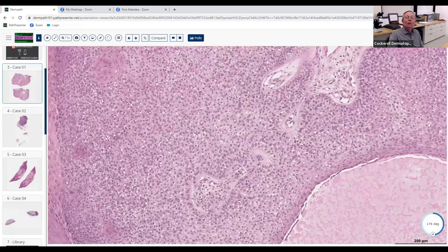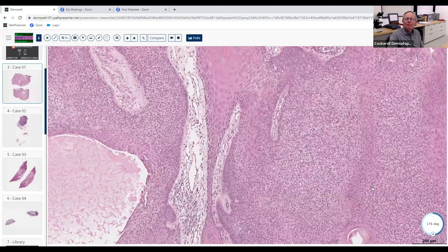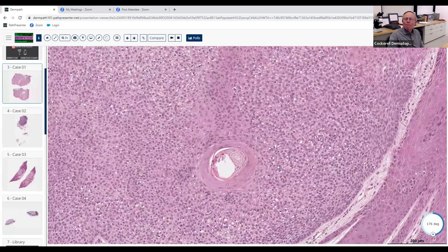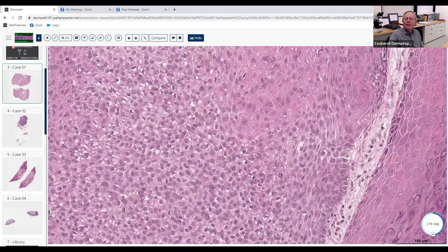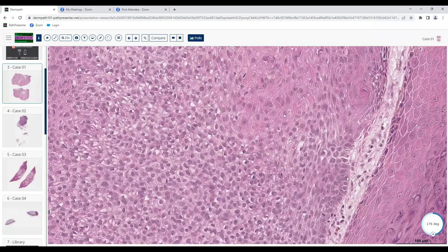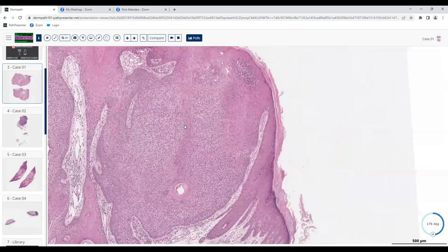They are a little clear — I totally agree. You mentioned ductal differentiation; let's try to find that. There's what looks like maybe an infundibulum of a hair follicle. What about the periphery — these cells versus these? It looks like there's palisading or a thickened basement membrane. I agree — these are more basaloid here and these are more clear.